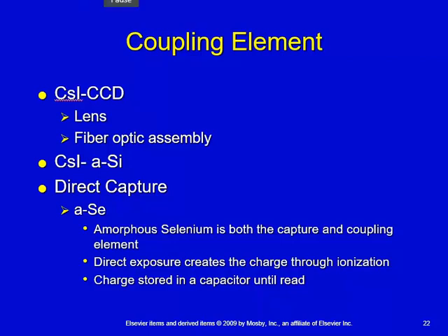And just going all the way back to first semester physics, if you don't remember what a capacitor is, it's kind of like a one-shot battery. We talked about capacitor discharge units where you plug the portable in and you build up a charge, and then you make your exposure, and the kVp would drop throughout the exposure. It's a capacitor discharge type unit. And a capacitor is just where you build that charge up, and then it stores that charge until you're ready to utilize it.